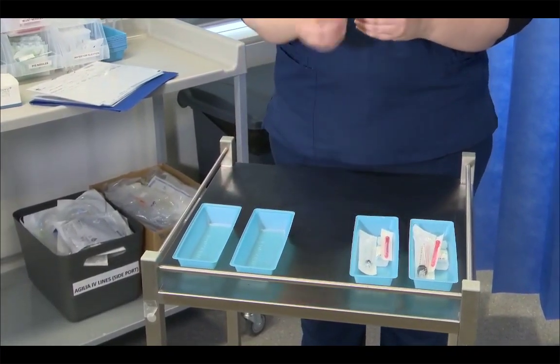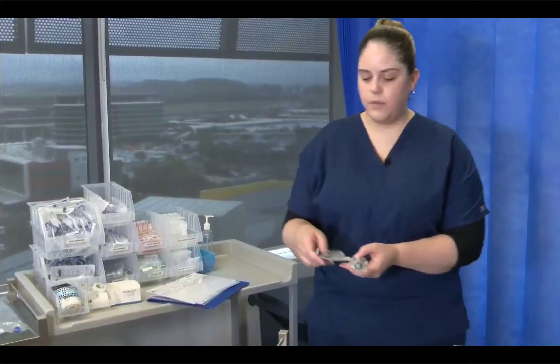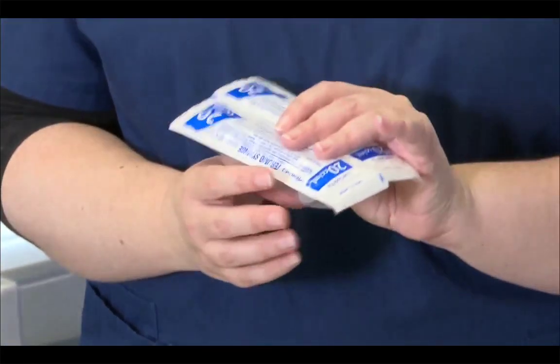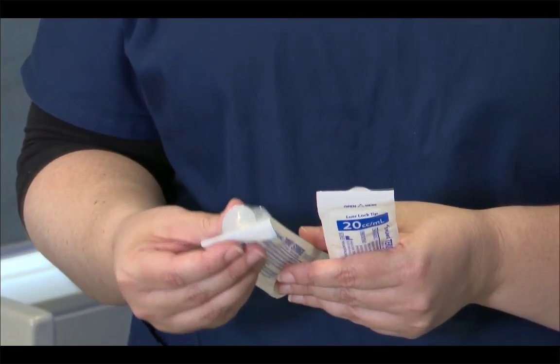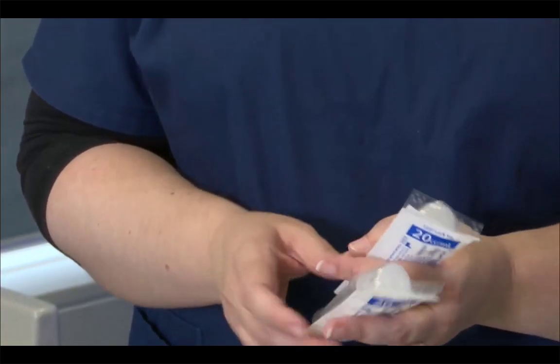The second 2 trays are for the fluid going in, meaning our S8 medication, and the fluid coming out, meaning the fluid from the bag that has to come out because we're adding a volume of fluid. For that I need 2 20 ml syringes. Again, Luer-lock syringes because we use Luer-lock to avoid sharps injuries. So I've got 2 20 ml Luer-lock syringes, and again I'm going to check the expiry on the flaps, and again that's 2028 and 2028.